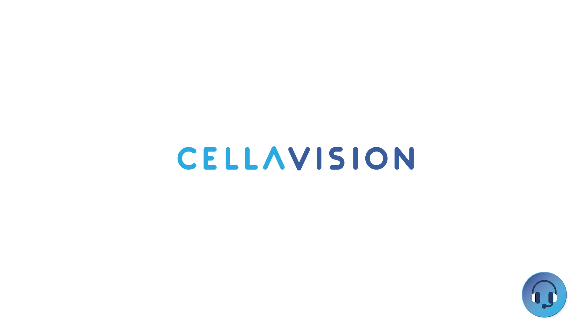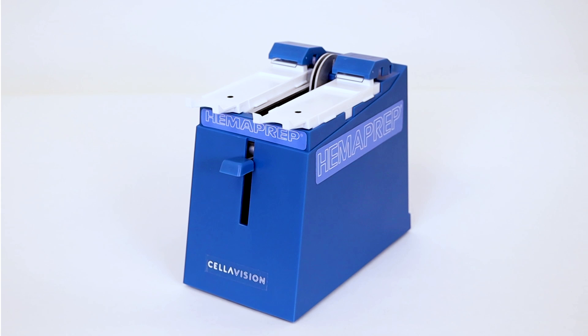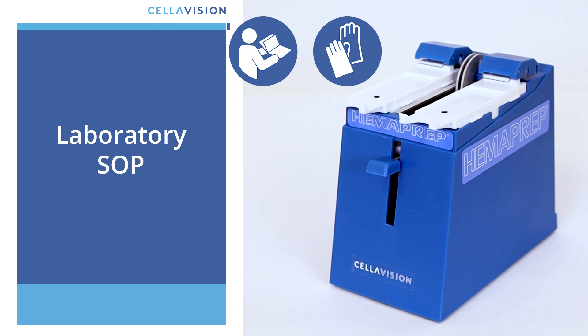Hello. In this video, we will show you how to use and care for your Hemoprep device. Make sure you are following your laboratory guidelines for good laboratory practice on how to handle blood tubes and blood smears.